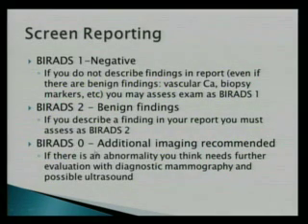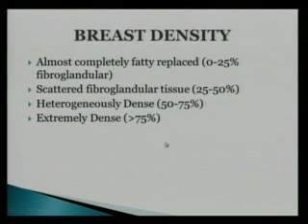And then a 0, again, is if they're going to come back for a diagnostic mammogram and you're going to possibly get an ultrasound as well. So what do we do after that? We're going to talk about breast density. That seems to be a big topic.